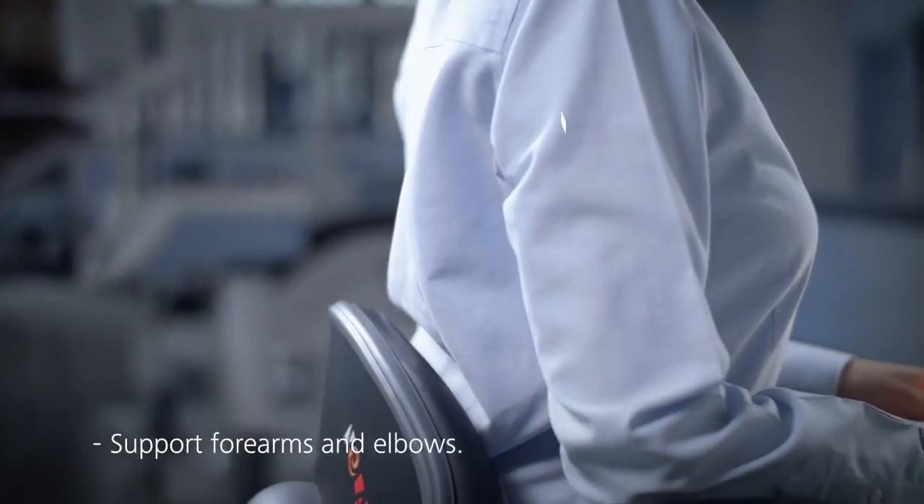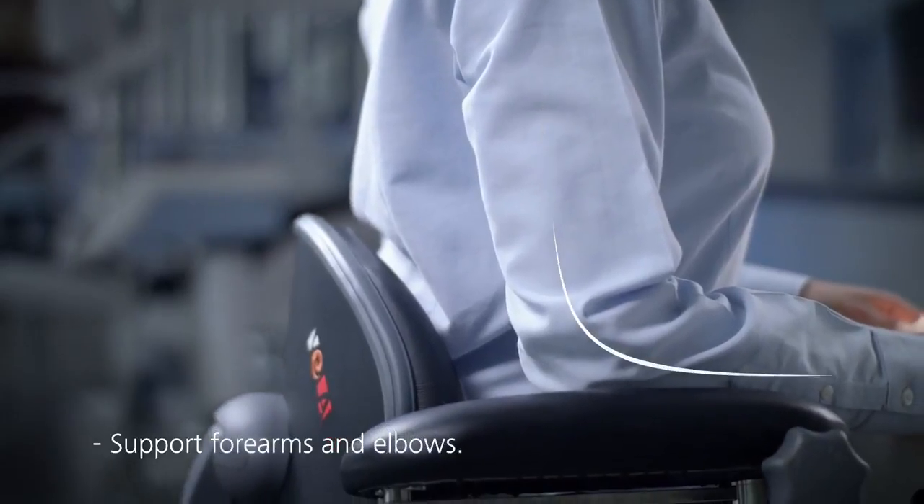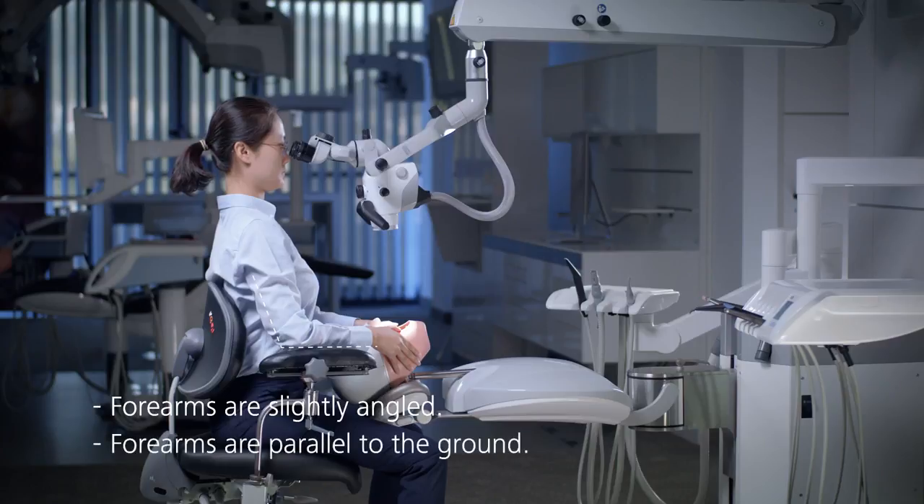Your elbows and forearms should be well supported, ideally by the armrests of a dental chair. Your forearms should be slightly angled towards the middle line and be roughly parallel to the ground.